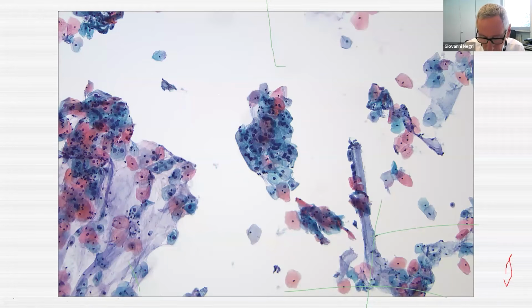And another borderline diagnosis, that one, look at low magnification. You see a high number of large cells with enlarged nuclei. So you think that's going to be an LSIL. Large cells, large nuclei, atypical nuclei.